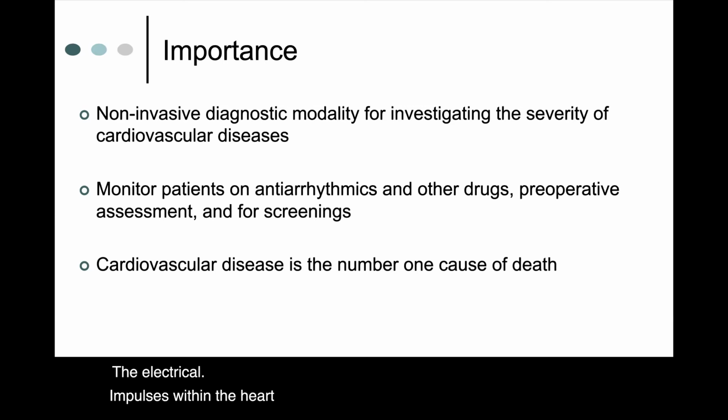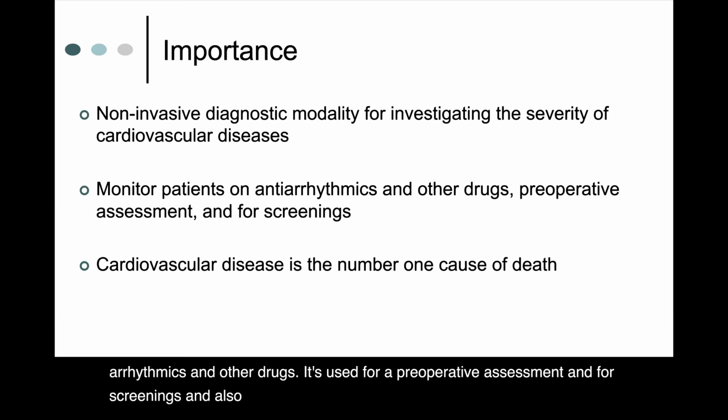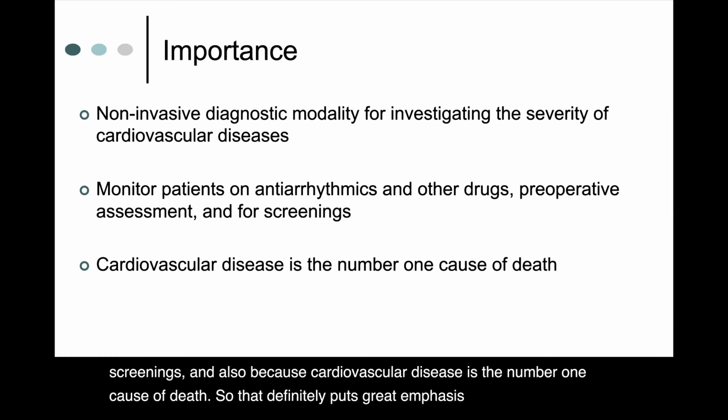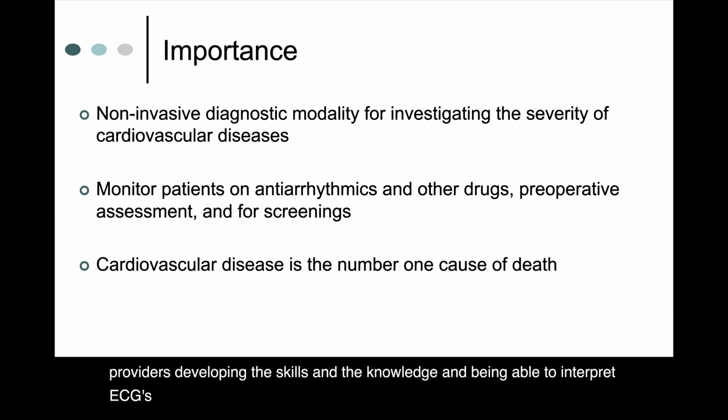It's also nice because it monitors patients on antiarrhythmics and other drugs. It's used for a preoperative assessment and for screenings. And also because cardiovascular disease is the number one cause of death. So that definitely puts great emphasis on healthcare providers developing the skills and the knowledge and being able to interpret ECGs to be able to provide the best care and promptly.